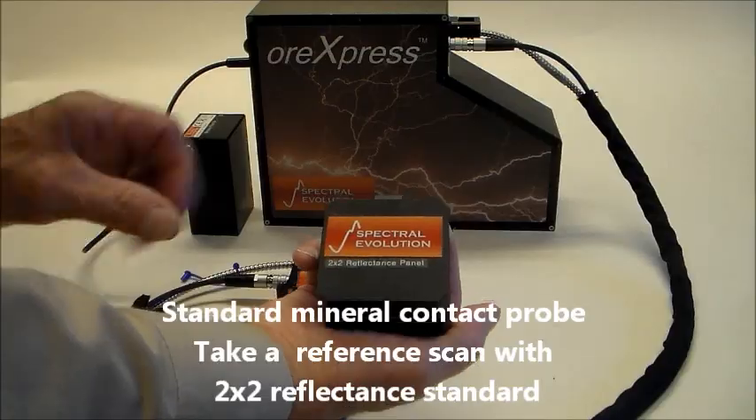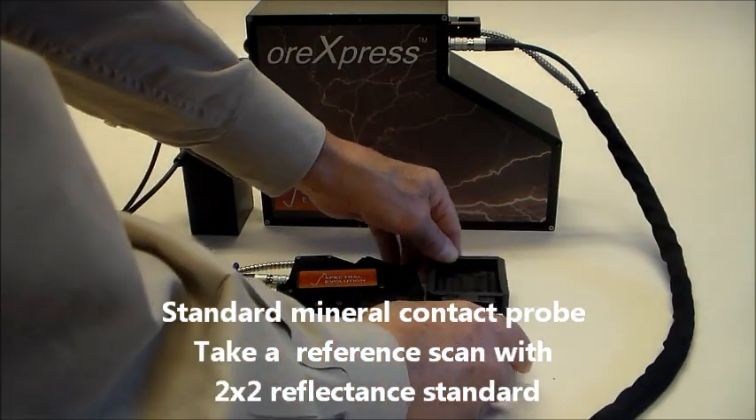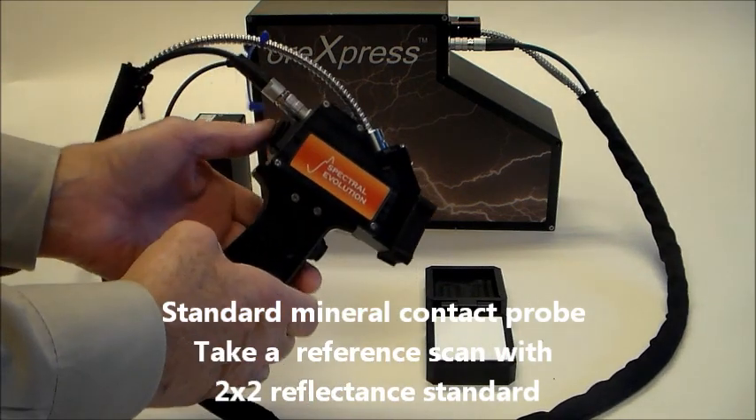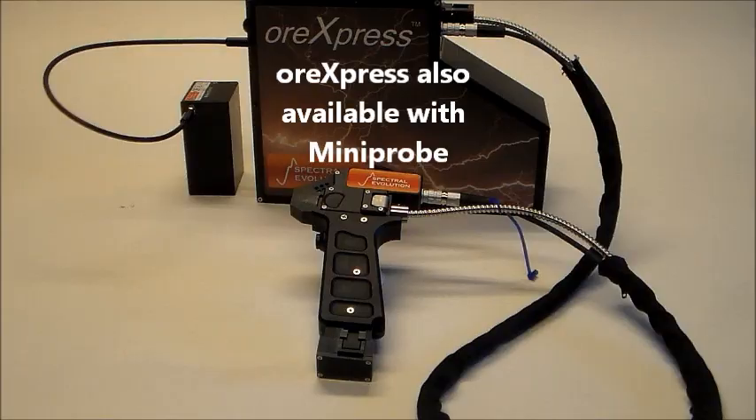To begin scanning with the mineral contact probe, take a reference scan using the 2x2 white plate. Hold the probe against the reference standard and select Reference Scan in the Darwin software. The ORExpress is also available with the mini probe that has a 3-millimeter spot size.